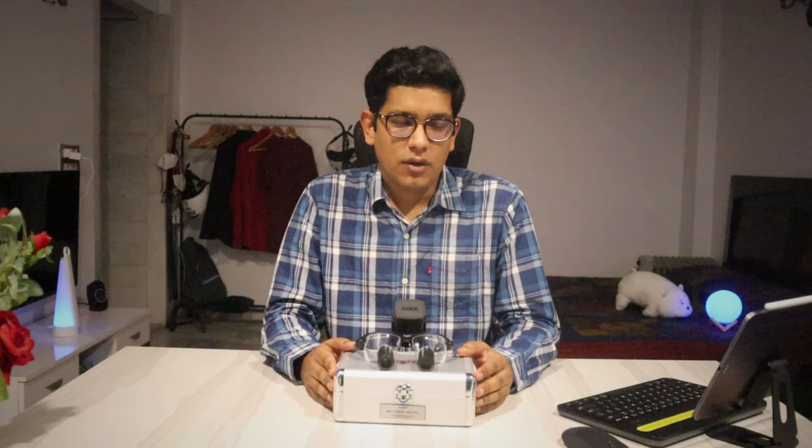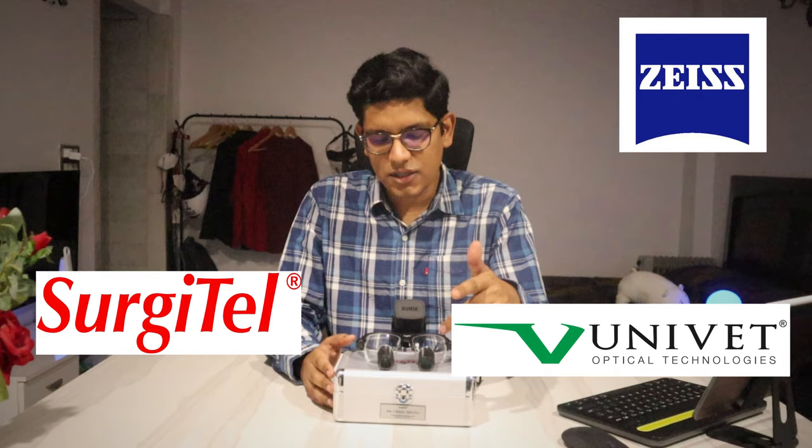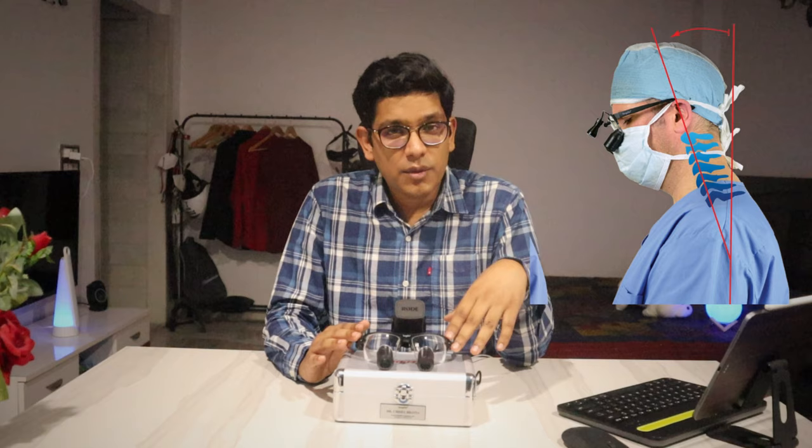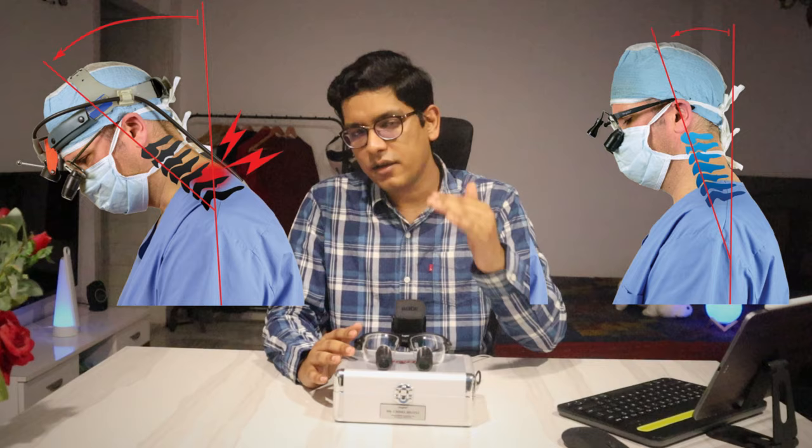Surgitel is just one of the companies making surgical loops. It's a big market and there are a lot of major players. I had shortlisted three companies mainly — one was Carl Zeiss from Germany, Univet from Italy, and Surgitel which is based in the US. I had taken demos from all of these companies and tried their loops. I finally settled with Surgitel because their loops are the most lightweight and they provide a very good declining angle, which is important because it doesn't hurt your neck when operating for long hours. Apart from that, the Indian distributor for Surgitel appeared to be genuine and I felt he will provide good after-sales service — so Surgitel it is.